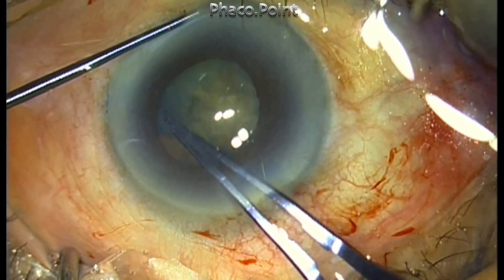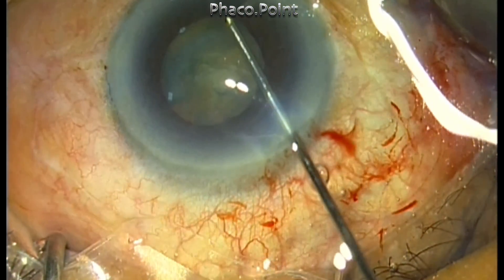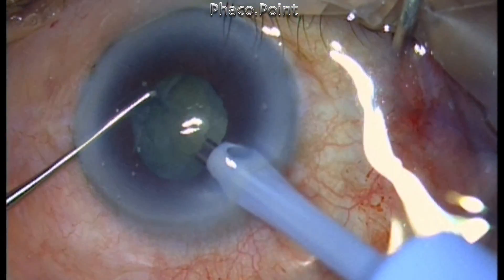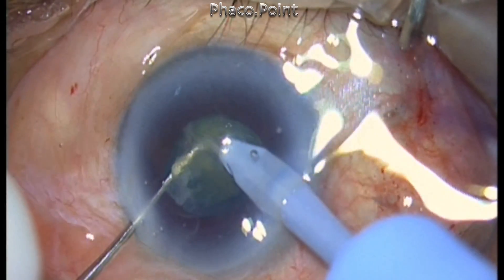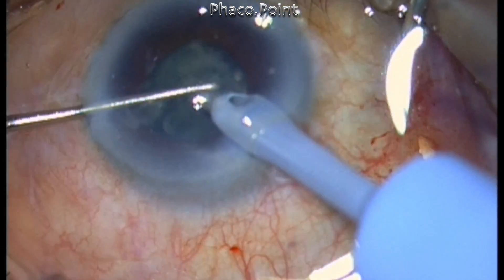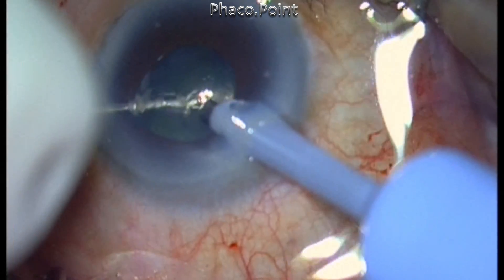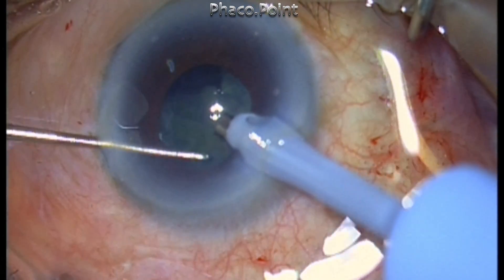Unlike the previous case, this one presents additional challenges including a shallow anterior chamber. The patient is on antiglaucoma medications with well-controlled intraocular pressure, but the chamber is very shallow. Cortical cleavage hydrodissection is performed, after which phacoemulsification is started using the same parameters as before: multi-burst mode with 25% phaco power and 300 mmHg vacuum. As long as we perform direct chop within the central pupillary area and achieve good cortical cleavage hydrodissection to enable nucleus rotation, the management of the case can proceed without difficulty.